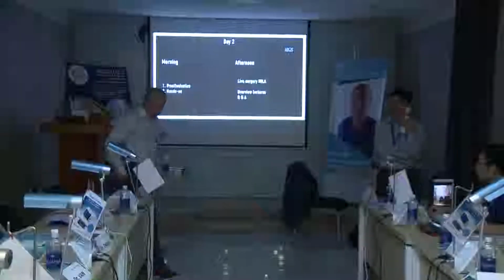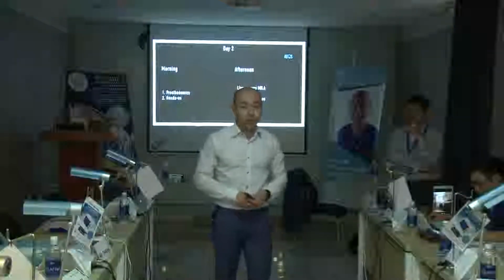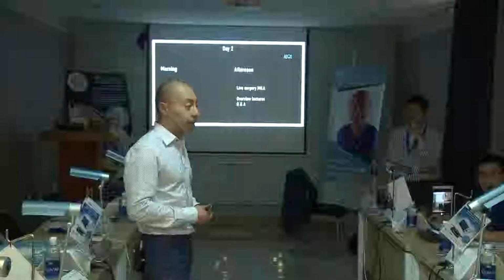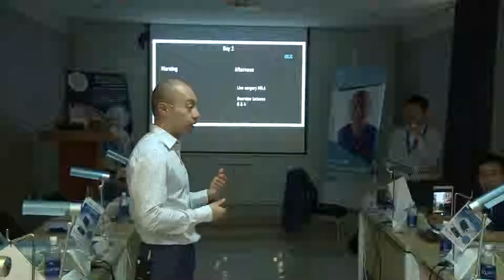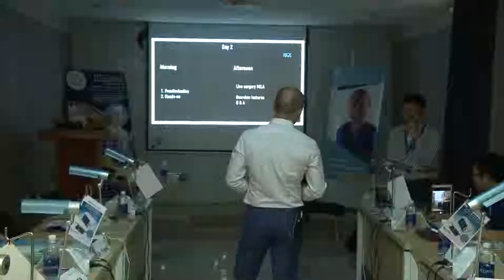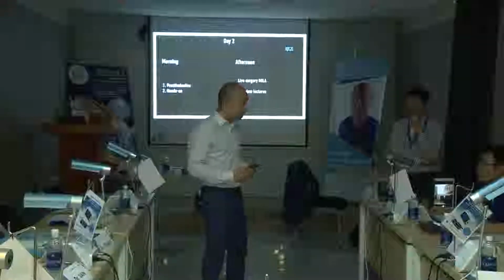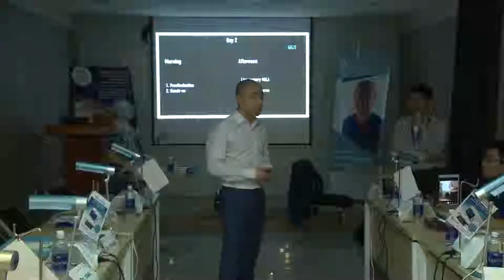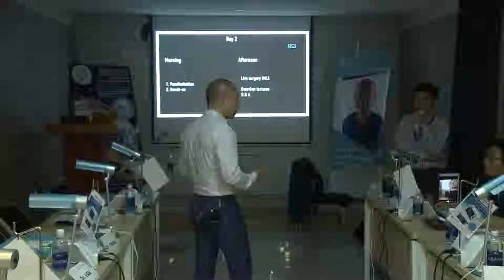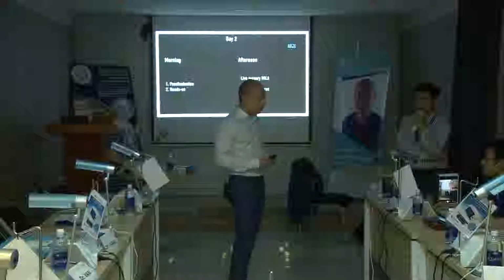So, yesterday we talked a lot about the surgical part of implant dentistry. But once you place the implant, it's also very important that you make something nice on the implants, the crowns. And I always try in my practice not to make crowns which are fake, but to mimic nature as much as I can with the techniques I have. And I also have to give them soft tissue to work with, so they can mimic it in the best way they can.